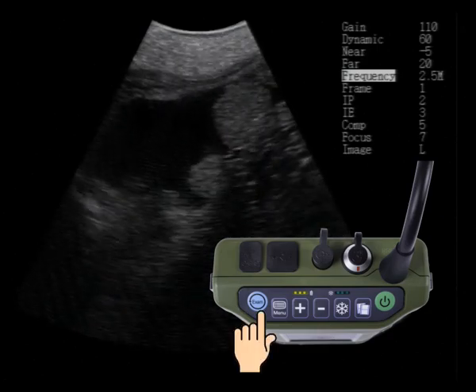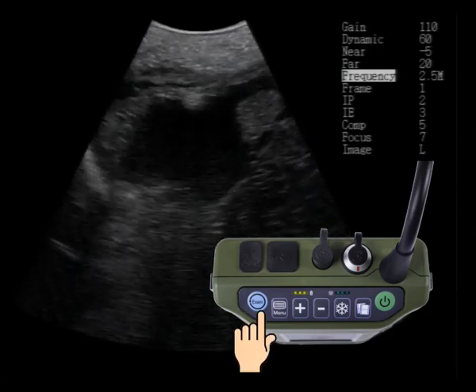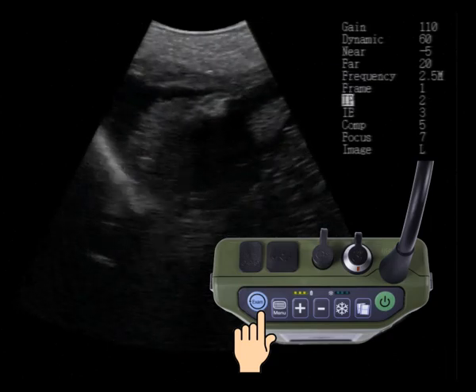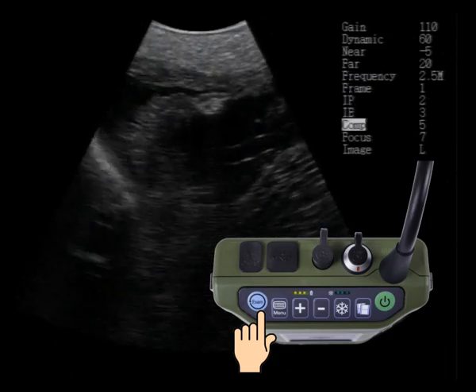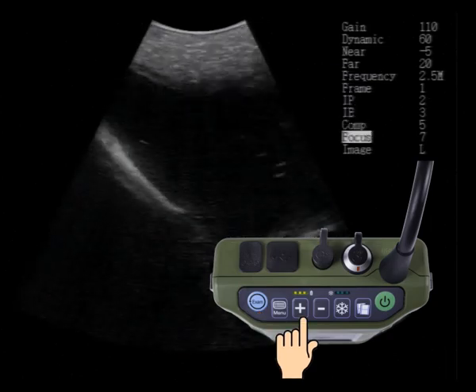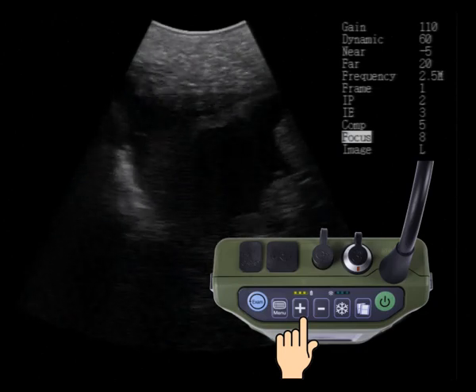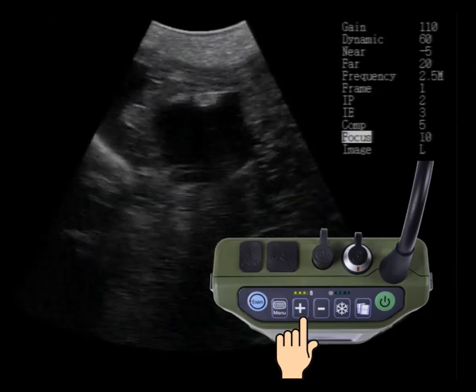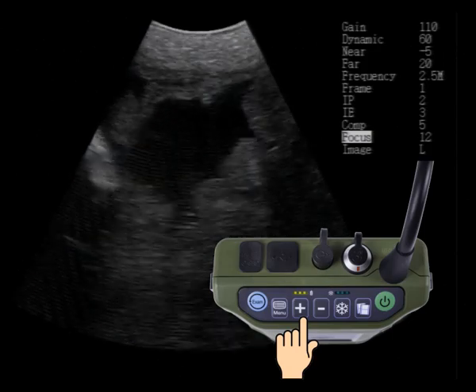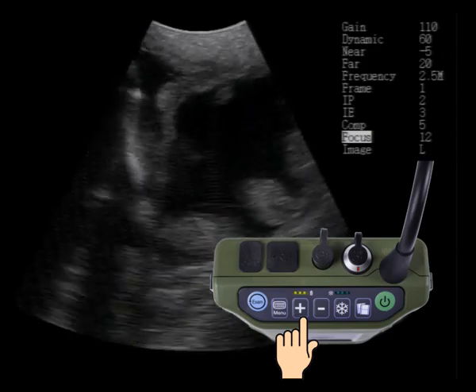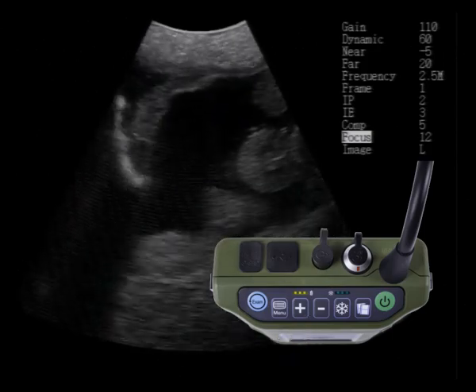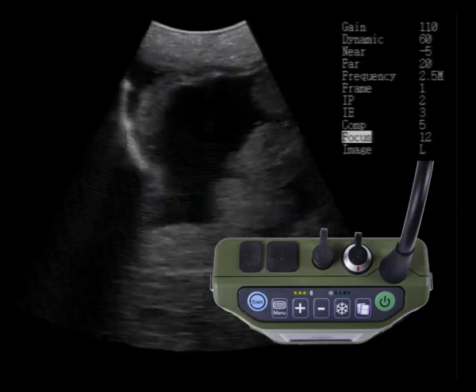We'll now press the exam button again, scrolling down the menu. We're going to increase the depth of focus to 12 — we could go to 16, but in this case we'll stop at 12. Our image behind us is getting brighter, and we want to get it brighter yet.